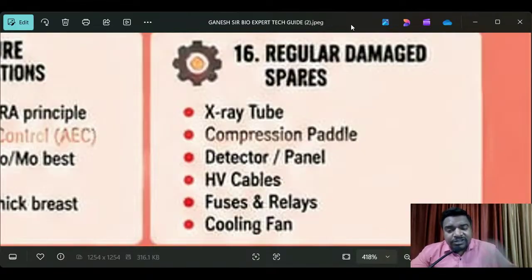Whenever you put in effort in a possible way, definitely you will get it. Why not possible? But the thing here is you have to diagnose pin to pin. You touch the machine, the equipment is not working, check power, next check fuse, next one by one. If you check it part by part, then you will get it and you will get practice. One day you may not get it, the second day you may not get it, but ultimately, if you maintain consistency in your work, definitely you will get it, right? Still, if you don't get it, then approach your seniors and try to know what happens, sir, why it happens, sir, why is it not possible for me, sir. Let's think about it and communicate.